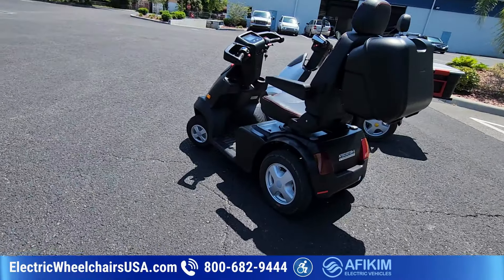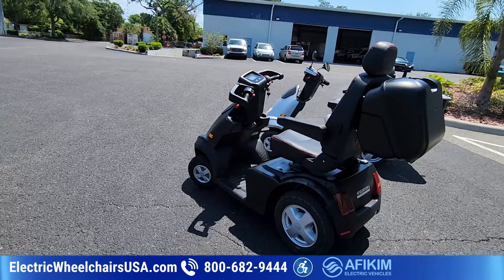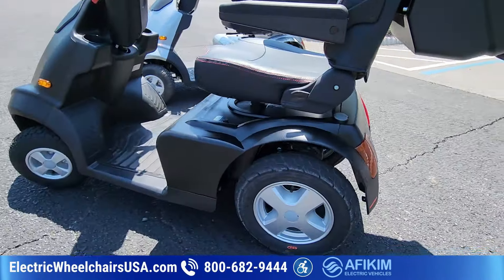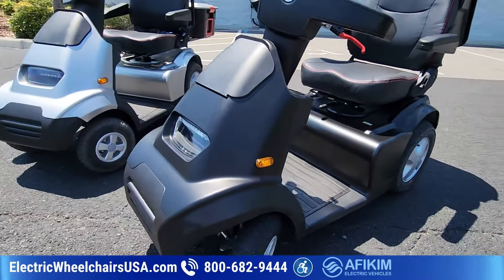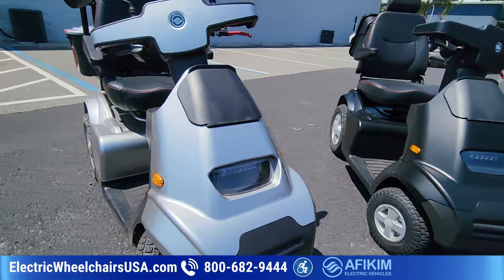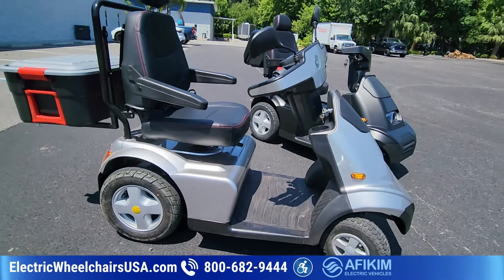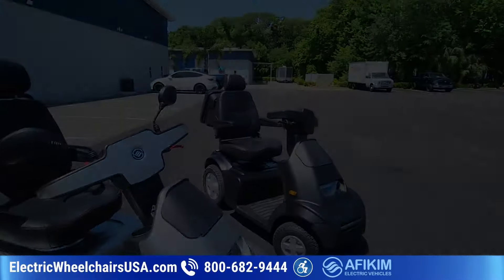Now, back to going over some of these features — 500-pound weight capacity. There is a heavy-duty suspension which you can add as an upgrade, and that will give you a 600-pound weight capacity. If you feel like you needed more weight capacity, these scooters can accommodate just about any rider.